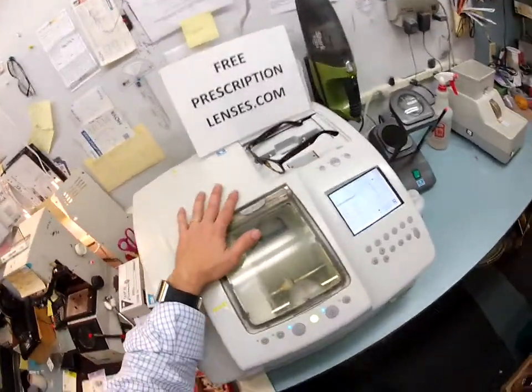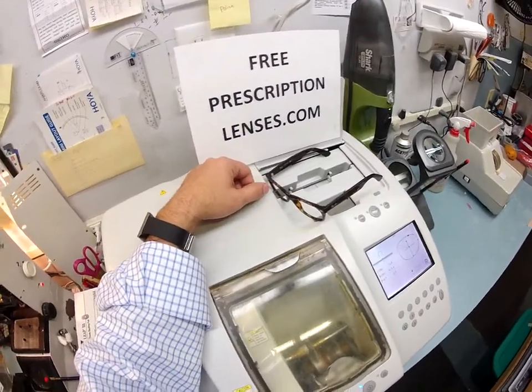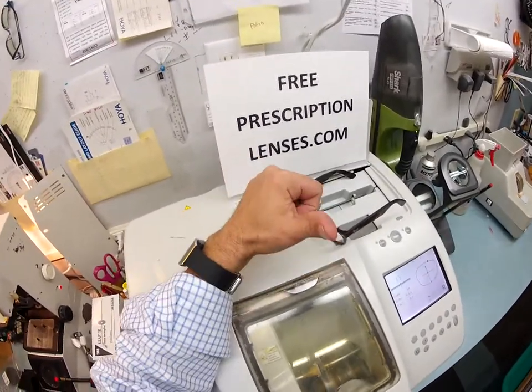This is a $30,000 edger. I recommend everyone go out and get one, put it on your kitchen counter, and then you can cut lenses at home — you won't need me anymore.